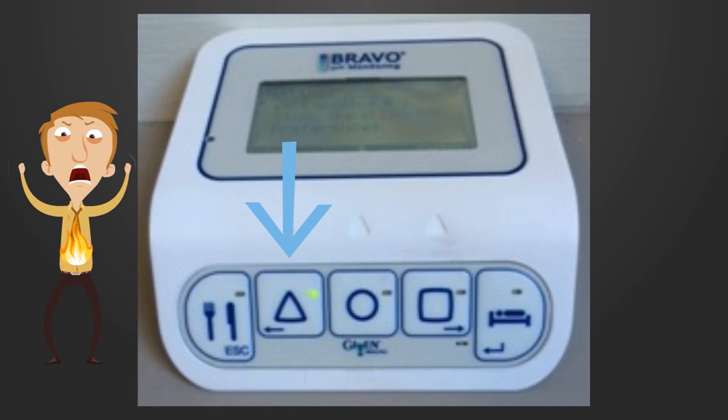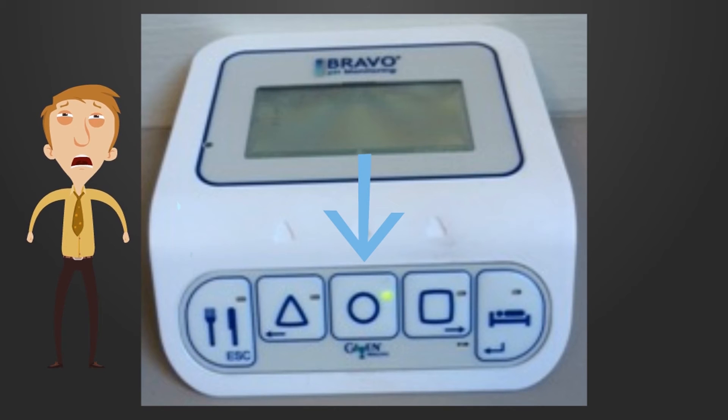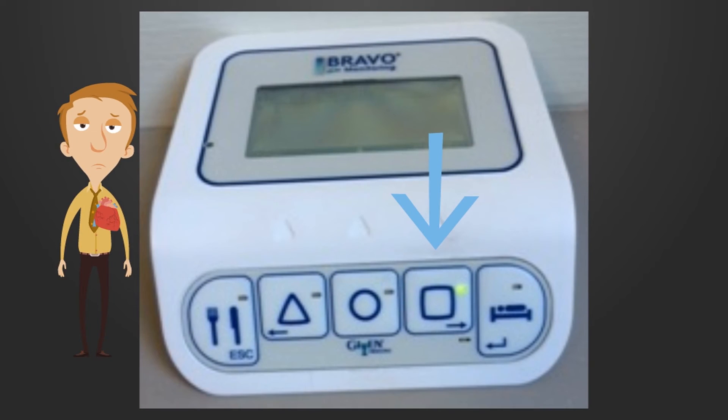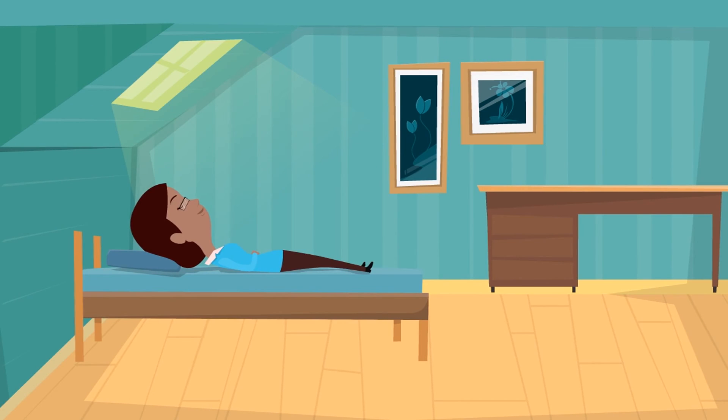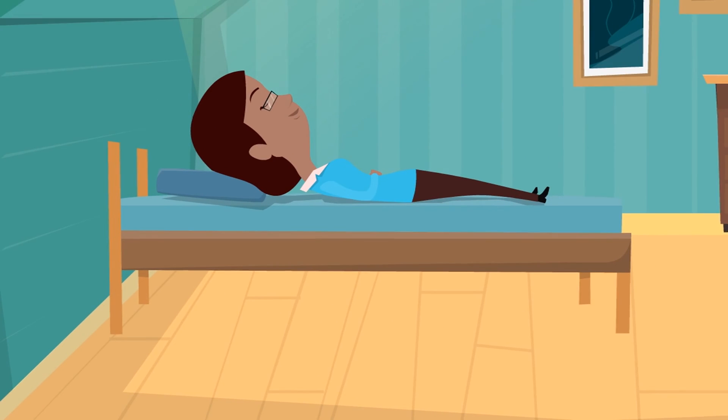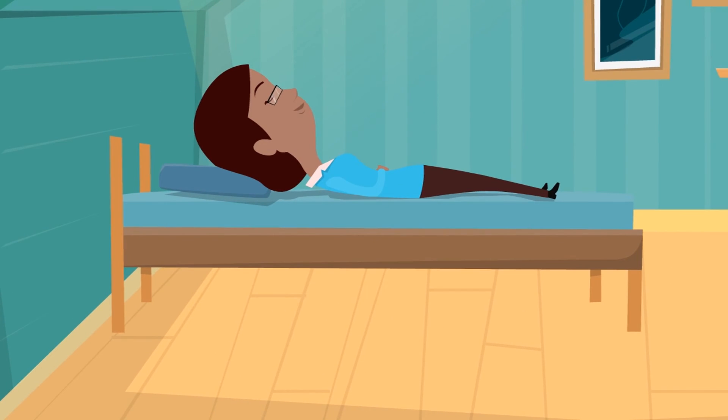Here's how to record your symptoms. If you have any chest pain, press the triangle symbol once. If you experience any regurgitation, press the circle symbol once. And if you feel any heartburn, press the square symbol once. If your symptoms are different, we can reassign the buttons to match your specific needs. Lastly, keep track of when you lie down — press the bed button at the beginning and end of your rest period. Make sure to lie flat when you rest or sleep. Remove any wedges from underneath you.